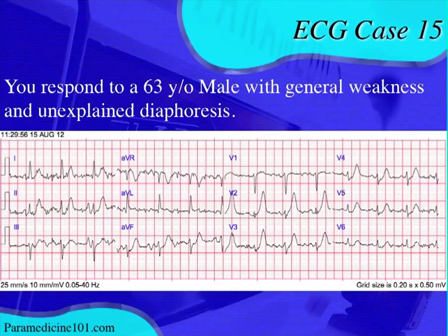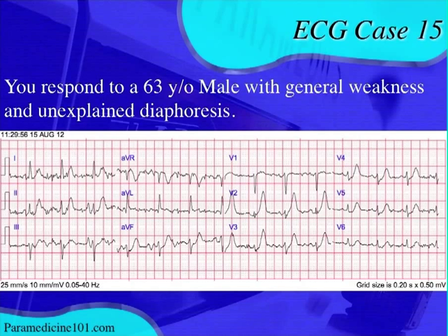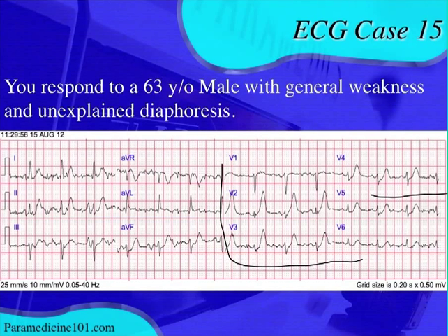The J point depression along with the broad-base, tall, symmetrical T wave is called Winter's T waves. Winter's T waves are indicative of an acute MI, most specifically found in the anterior leads, indicating an early anterior wall MI. So when you see these tall symmetrical broad-base T waves with J point depression, you have to think this patient may be having an MI — and the diaphoresis is now explained.